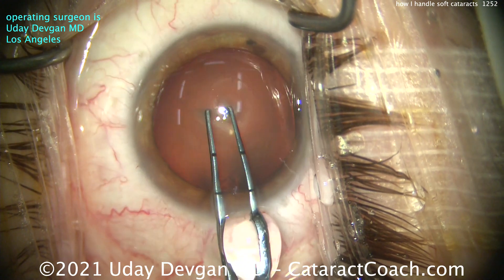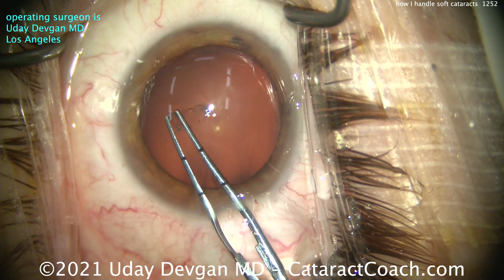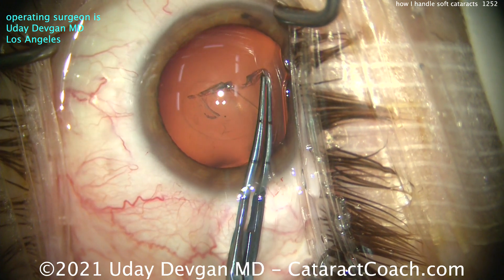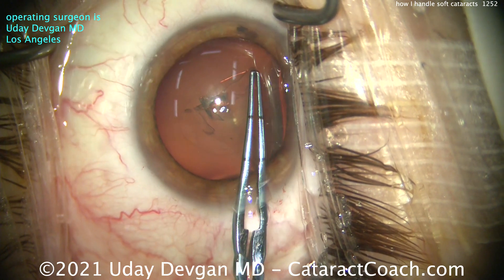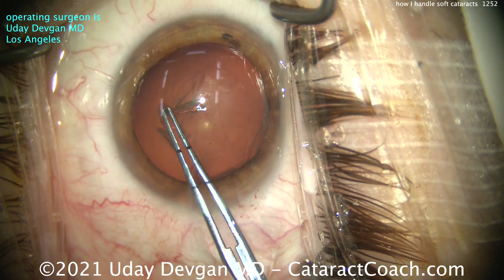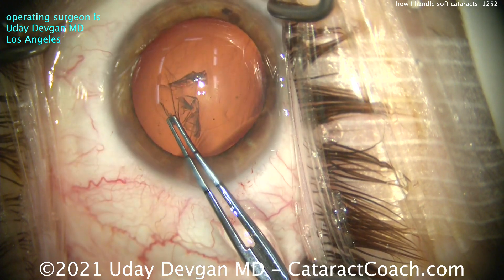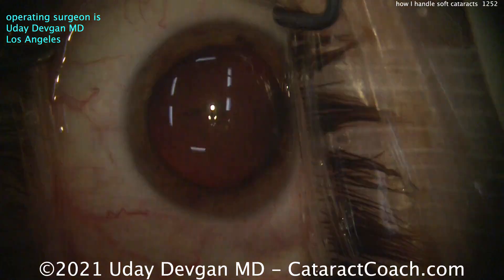I want to measure out my rhexis here. We're going to show you the complete cataract case. Here comes the rhexis. I really want this centered on the patient's visual axis, and that's why it's slightly nasally displaced. I really want it to be a beautiful five millimeter rhexis — I don't want to have anything irregular here. I want that rhexis to overlap the optic 360 degrees. A rhexis of five millimeters would be just about perfect, and I just measured it at five millimeters.